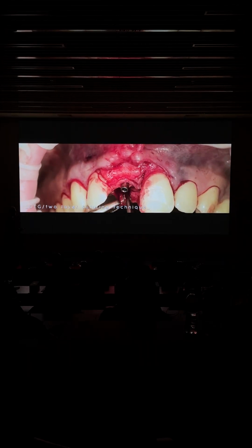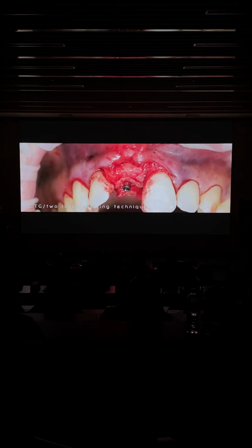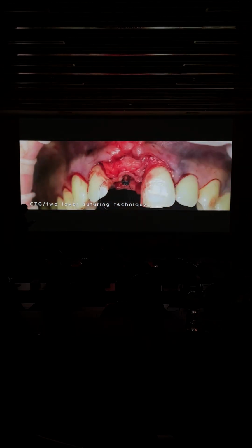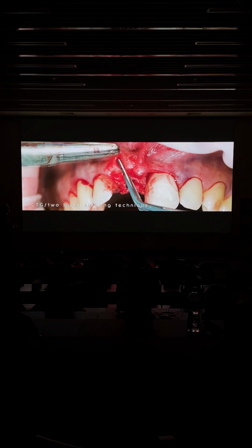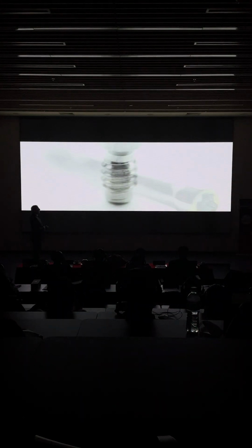You can see that this healing abutment is 7 millimeter high, so we are just bumping the tissue in one shot around 6 millimeters. Okay. So this healing abutment only helps the surgeon.